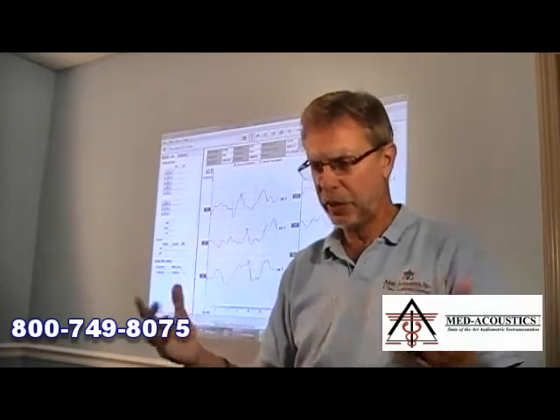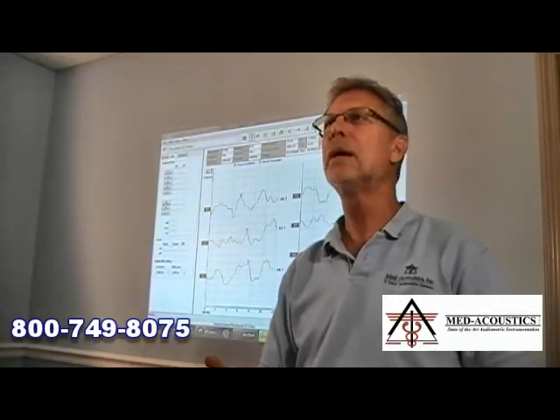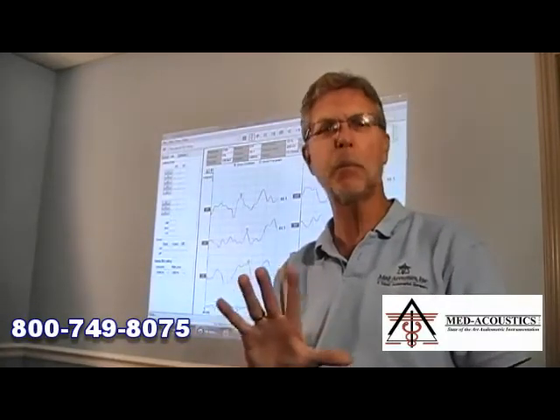So this way, when a pediatric patient is not sedated and not just sitting or lying down quietly, perfectly cooperating, right? Not sleeping either. When they are awake but naturally the type of patient that can be relatively calm if you blow bubbles for them or play blocks with them or let them watch, maybe without the sound on, a video. If it's that type of patient, a reasonable pediatric non-sedated case, then this works great.